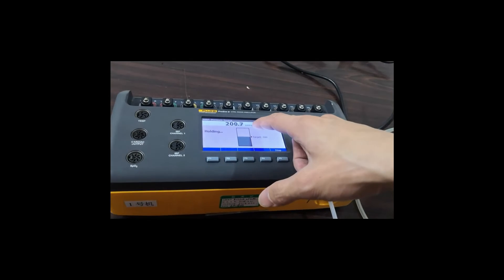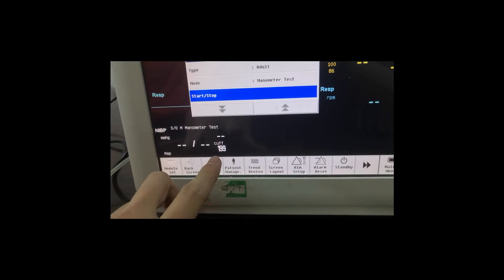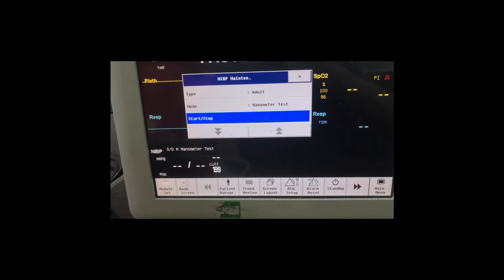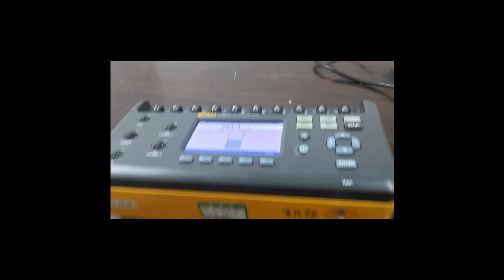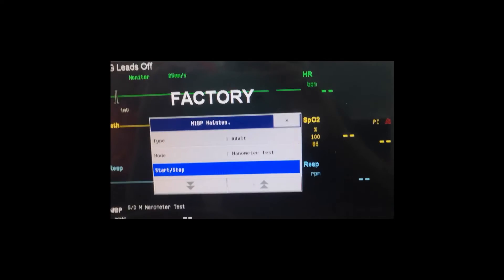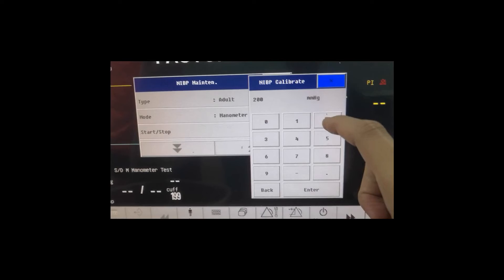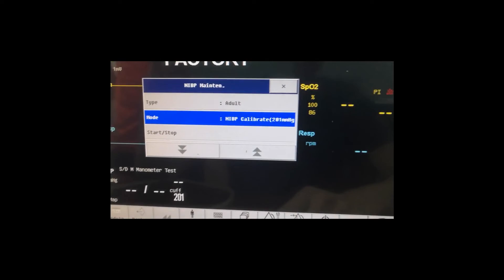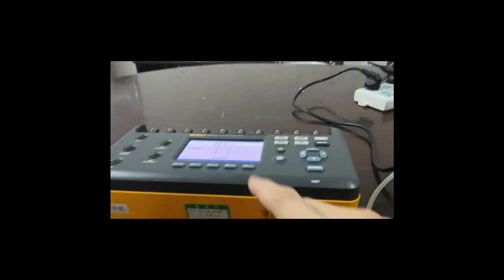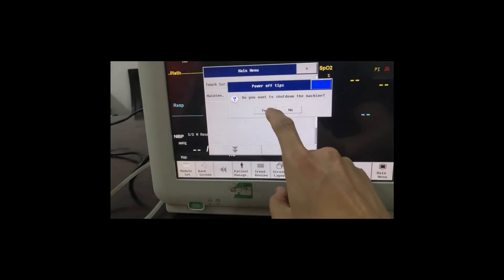Now we just focus on the number here, and then focus on the number here. By the way, the normal tolerance for the NIBP should be plus and minus 3 millimeters of mercury. As you can see, the number here is 201. You can set it up like this, then back to the menu and stop the simulator and restart the machine, then it will be okay.